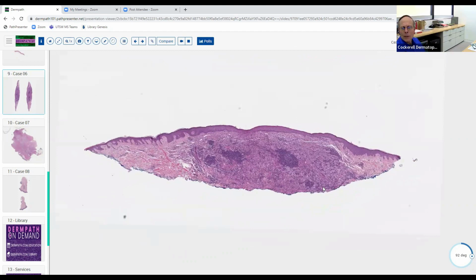What kind of cells do you think they are from afar? It's hard to tell from afar. Probably the darker nodules, I would guess lymphocytes, but that's really not even a guess. That's a very educated, smart answer. So these are probably lymphocytes. There may be some other cells admixed in here. You can tell they're not totally jet black. There may be some cells that are a little paler. We'll see if we go to higher magnification.